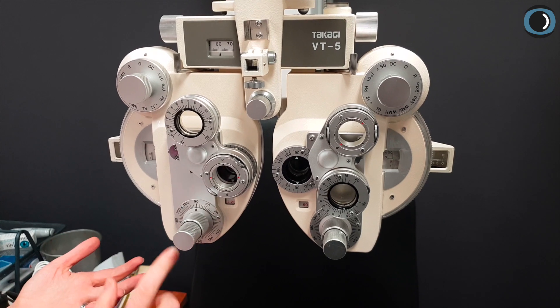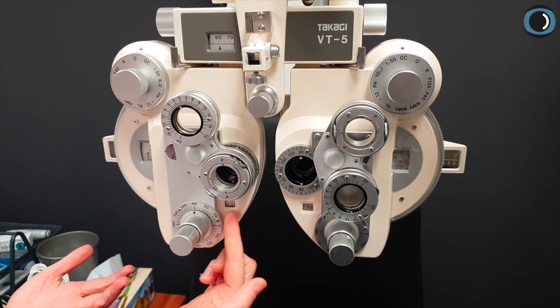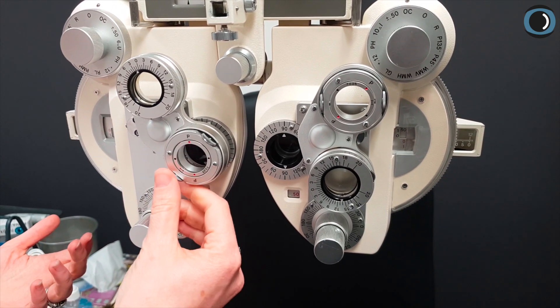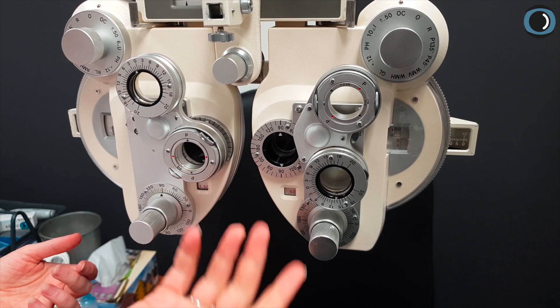Say for example we've got a patient with higher cylinder. Now I've got a patient who's minus 125 by 90. Let's show them first of all 150 cylinder. Which do you prefer, red or black? They're going to prefer black.